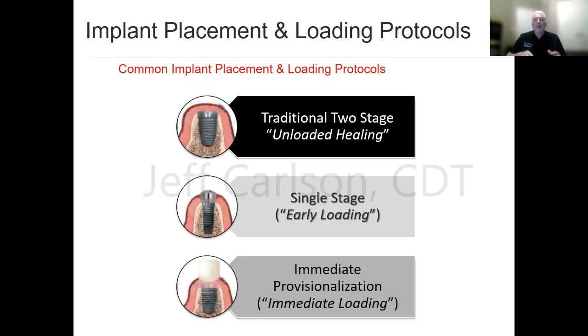And then if sutures are required, suture around the contours of a crown. This is probably the preferred way in the aesthetic zone. Just have to be careful about how you're going to load that, as far as occlusion. What kind of stability do you have, any parafunction, keeping in mind the bone quality as well.